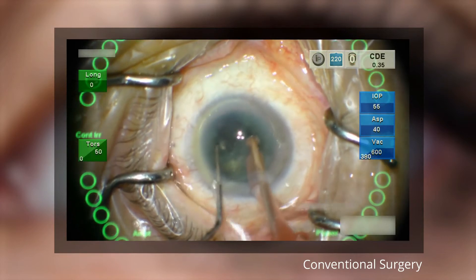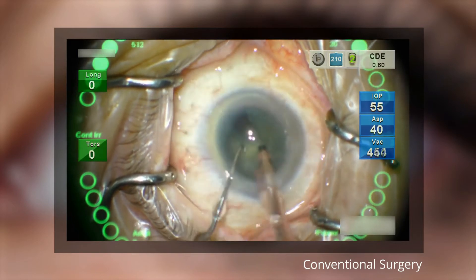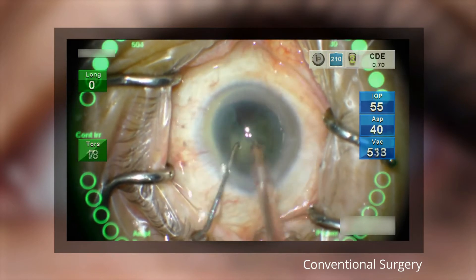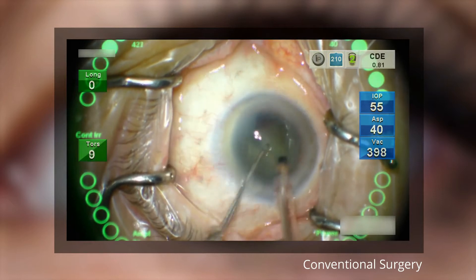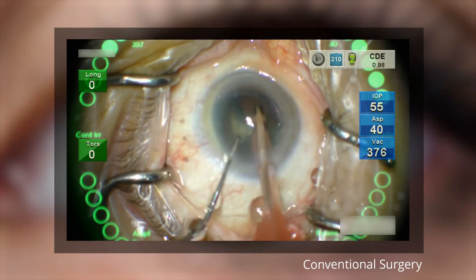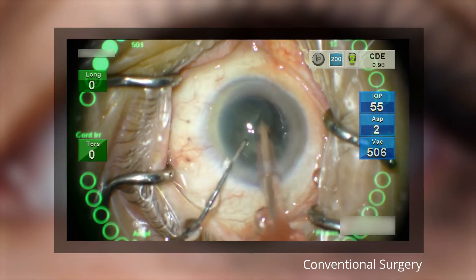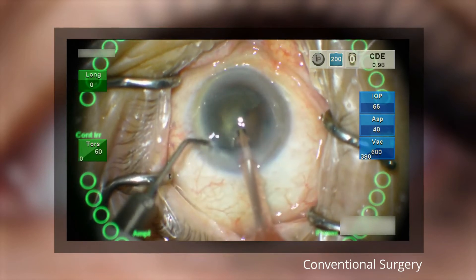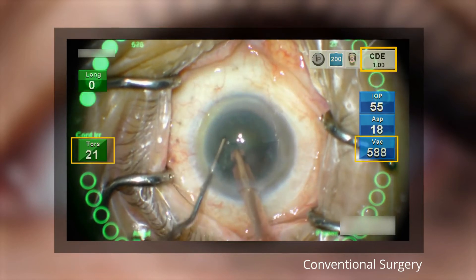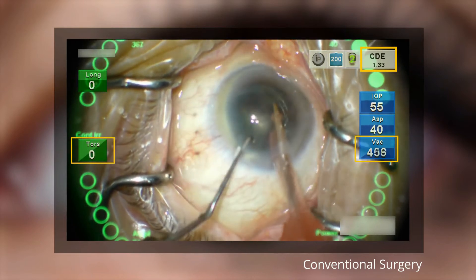The phaco tip is placed in the central anterior chamber just below the iris plane to optimize outcome by avoiding phacoemulsification and aspiration occurring too close to the cornea or posterior capsule. The tip is positioned with the bevel facing down to reduce effects of cavitation and minimize turbulence, which may help protect the endothelium and contribute to low ECL. You can see the CDE at the top right, vacuum at the right, and the torsional power at the left, all working in sync.